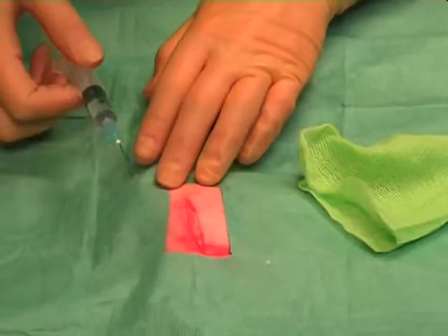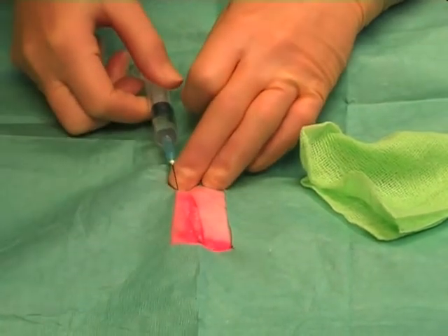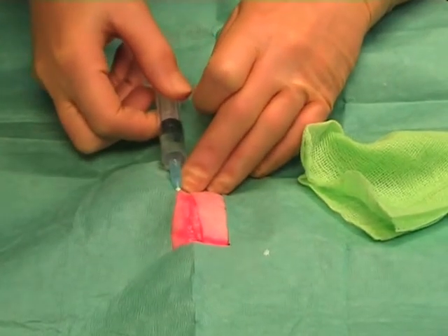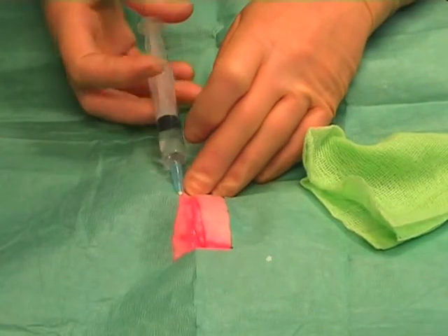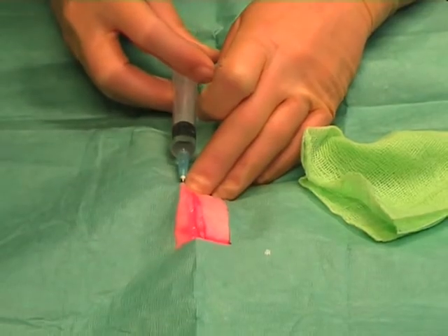Repeat the process on the opposite side of the wound, running the needle parallel along the wound edge. Draw back, make sure you are not in a vessel, and then again inject as you withdraw.